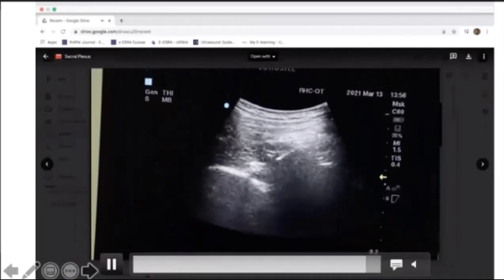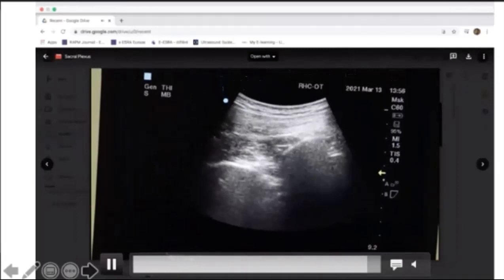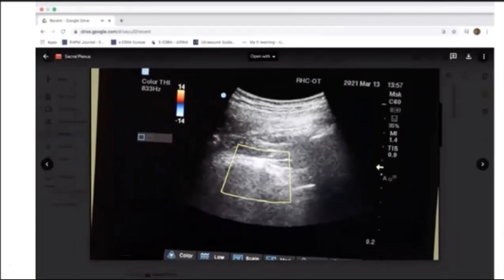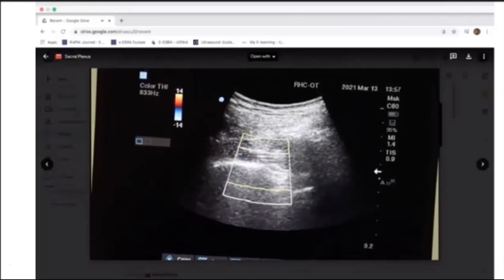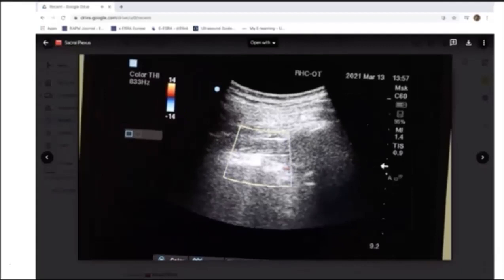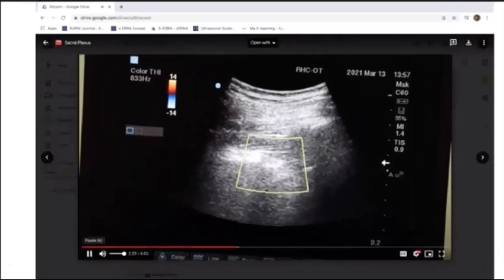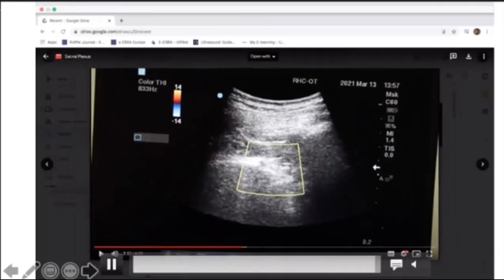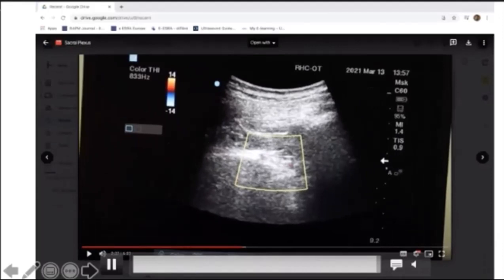With the probe oblique for this block, needling in-plane is very difficult, so I use an out-of-plane technique. The important step is to identify vessels using color Doppler: on the medial side is the inferior gluteal artery and vessels. If doing in-plane technique, the needle should come from lateral to medial, away from this artery. We also confirm the sacral component with PNS - so it is again a dual-mode block.